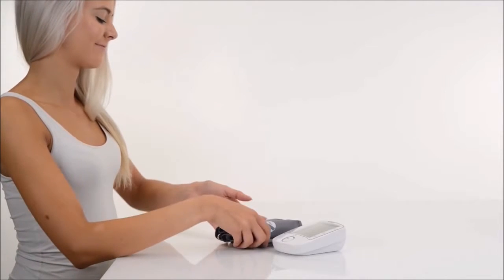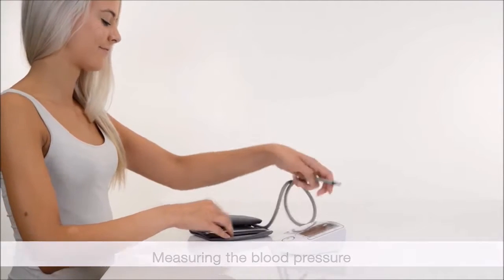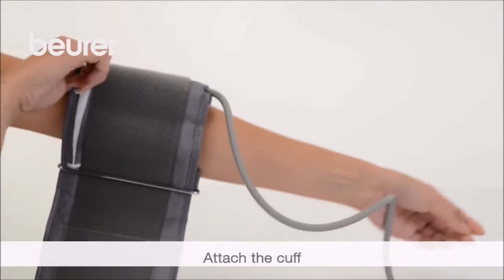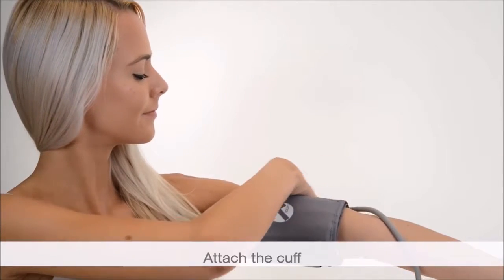Let's move on to measuring the blood pressure. The measurement can be performed when sitting or when lying down. Adopt a comfortable posture. Position the cuff on your bare left upper arm 2 to 3 cm above the elbow. The cuff must be level with your heart.